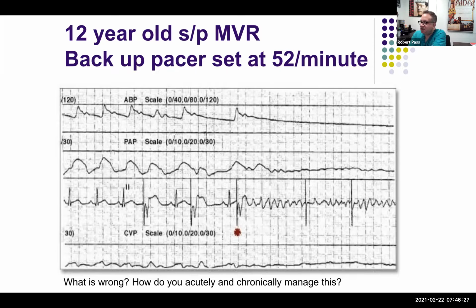And so I would caution you, obviously, if you're worried about bradycardia, it's not wrong to have it on, but if you have a patient who's 2 or 3 days after surgery and has had no conduction problems, it's not unreasonable to leave the pacemaker attached to the wires, but I'm not sure I would leave it in a sensing mode, because every once in a very rare while, something like this will occur. And when it happens, it's very frightening.